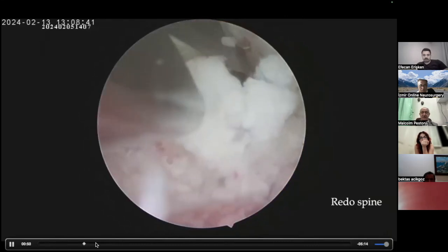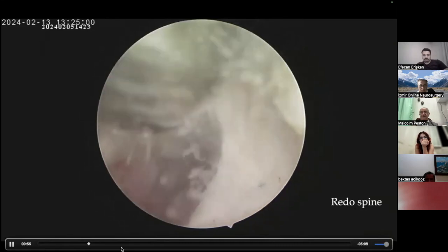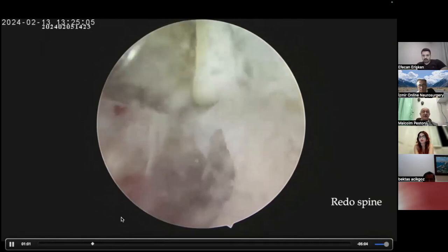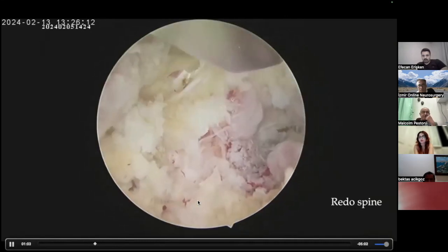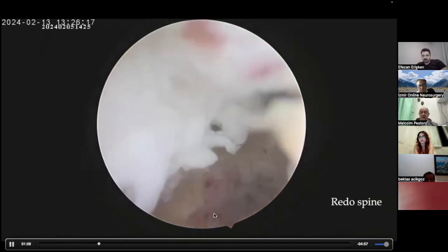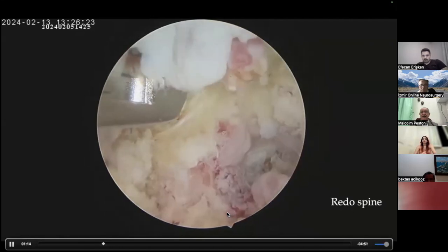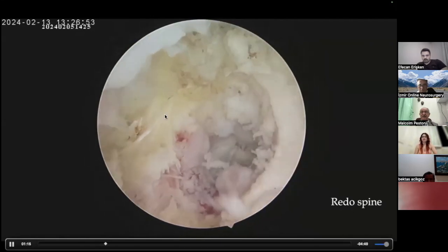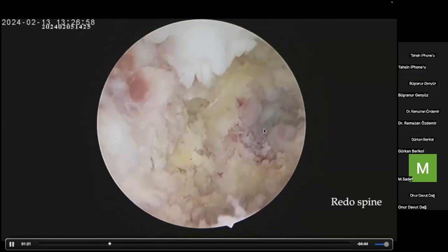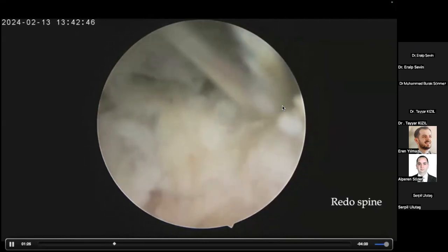This is backing out the screw, going into the screw canal, seeing where it is, trying to identify the fractured piece of the IAP. You can see the dural surface over here. That tissue over there is the synovium of the facet joint. But as I'm cutting away this synovium tissue, I see the flavum is intact. So where my screw fractured and pushed this piece of bone in, I can see all the synovium and everything, but there is nothing bad there. So that root has not got damaged.